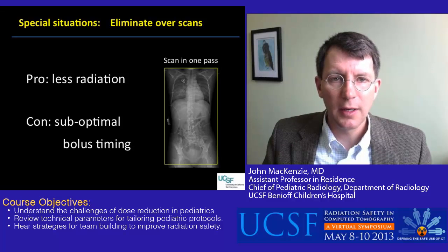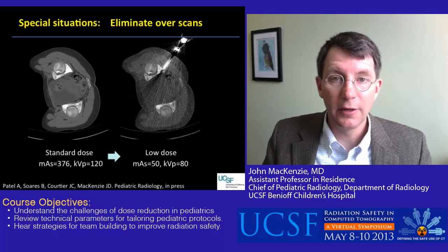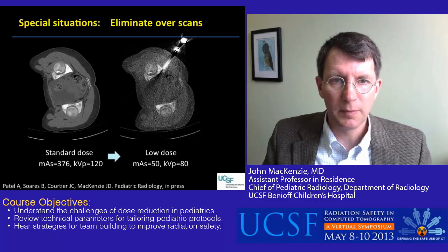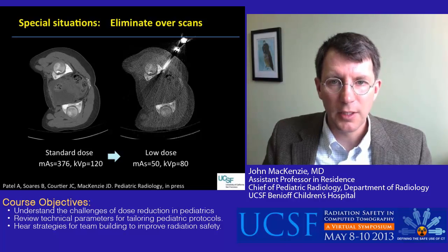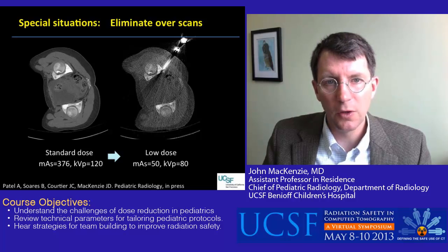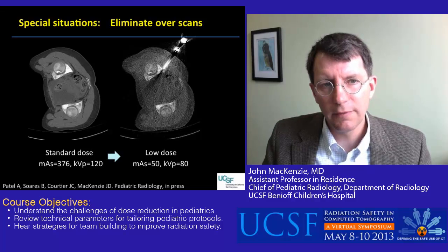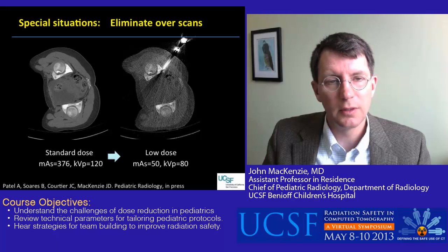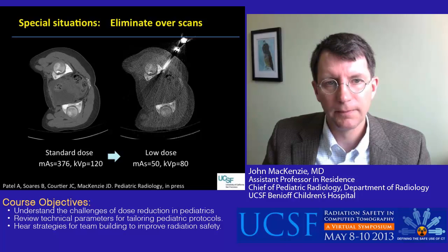We also dial down the dose when performing CT-guided interventions. Here's the diagnostic scan prior to placement of the needle with scan parameters as shown below. Our subsequent passes are performed at a very low dose, often the lowest dose the manufacturers will allow. The dose savings here is tremendous. Often we achieve a 95% reduction in dose, and our ability to target the lesion and obtain good tissue is not compromised.